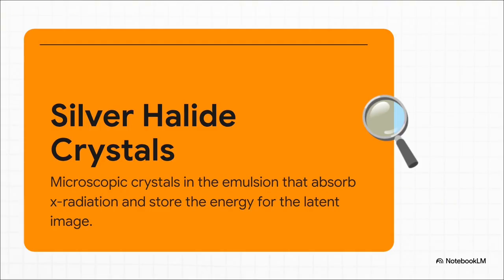Just picture them as these teeny, tiny energy sponges. When X-rays hit them, they just soak up and hold on to that energy. The more X-rays that hit a crystal, the more energy it stores. And that pattern of energized and non-energized crystals, that's our invisible latent image.